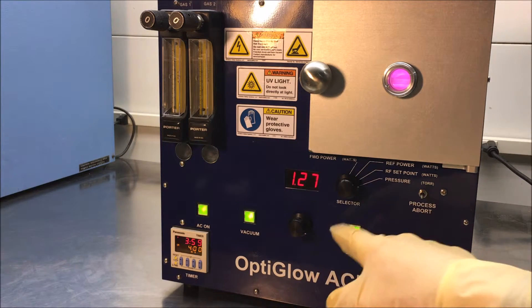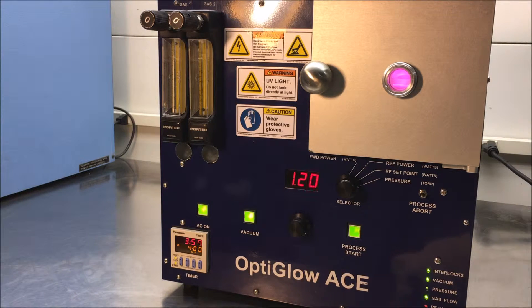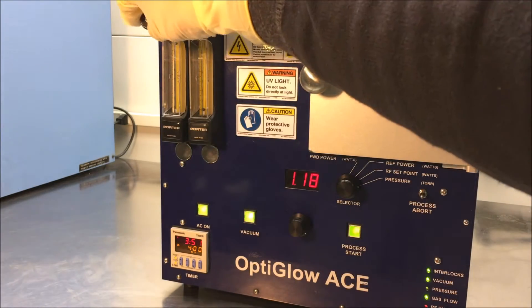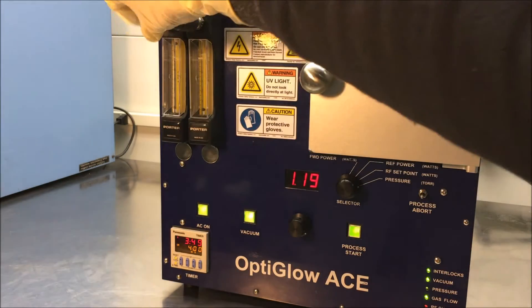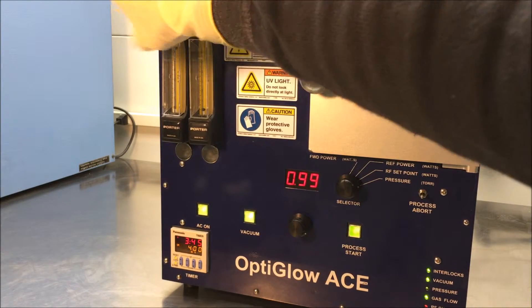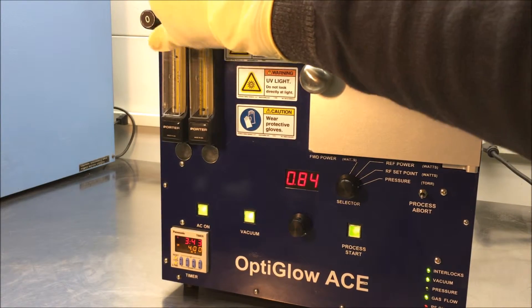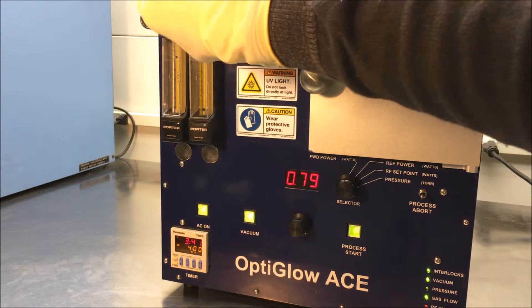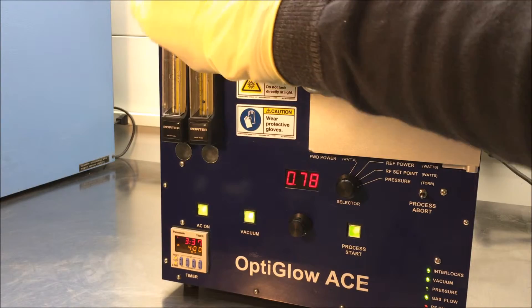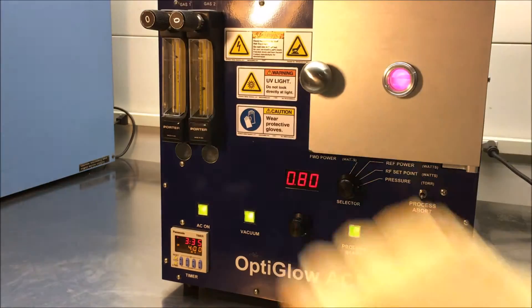When you do a crossover pressure of 0.35 torr, you'll ignite a plasma. Typically it's a good idea on your flow to operate around mid-range. You'll notice on this one it's very high, and on this one it's very low, so we'll bring that one up. As we allow for more gas to come in, the pressure will go up.